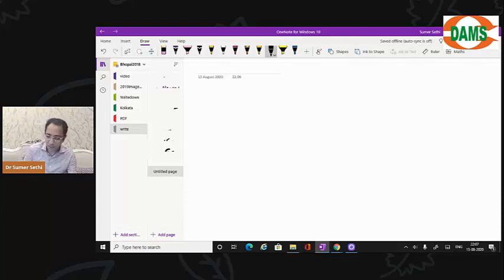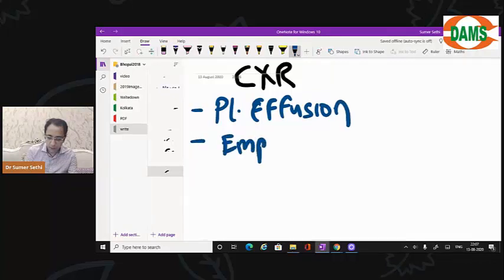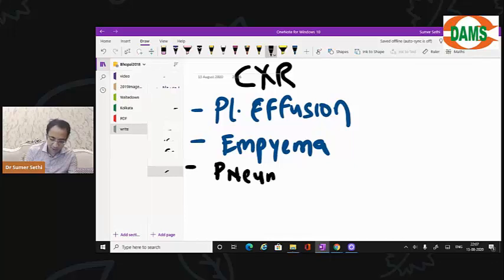Okay, so let us revise. Let us see what we have done so far. We started with chest X-ray, and I have made you aware of terms like pleural effusion, empyema. Are you able to recall all that? Pneumothorax.